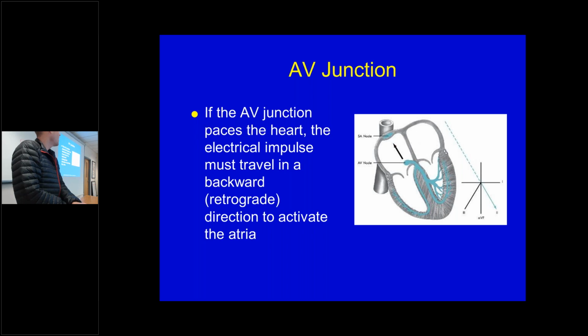So I drew up this diagram, and we had a picture of it. You have it in your handout, the heart and where the leads are in the heart. That's kind of where the leads are placed on the body, right? Have you guys heard of Einthoven's triangle?